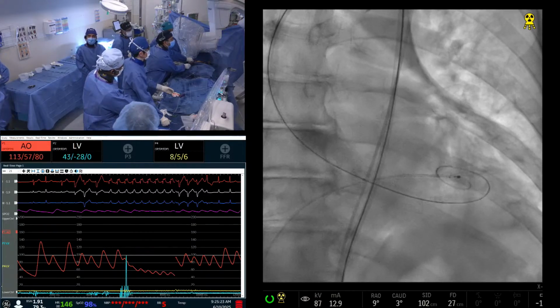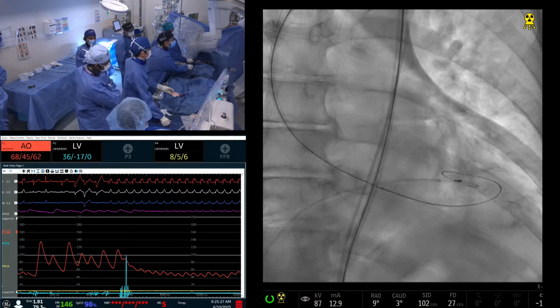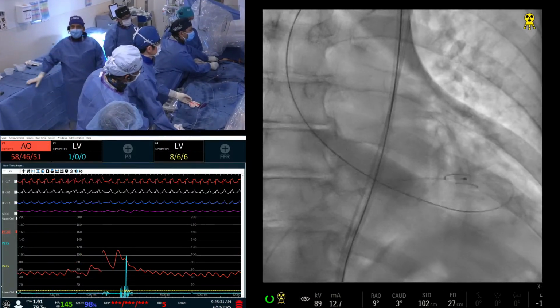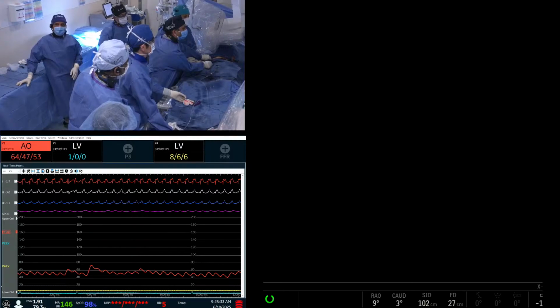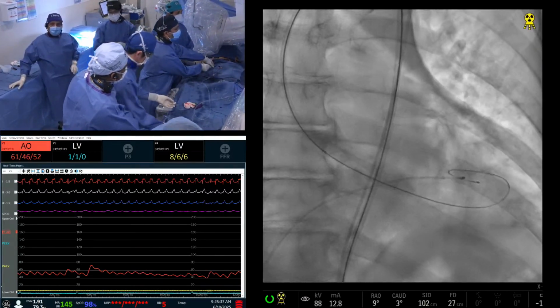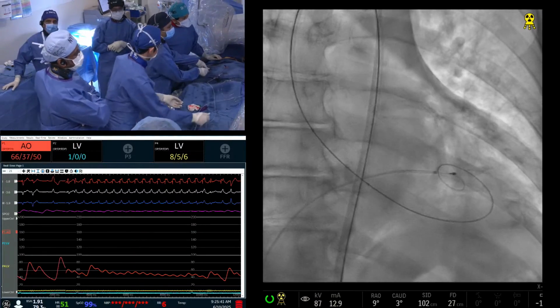And I think more and more data will come that TAVR recoil is a true phenomenon. Yes. And we have seen a few cases: a perfectly working valve, deployed at time 0, and after a few months there is recoil and a clear-cut high gradient and some PVL. We go back and say, what did we do wrong?